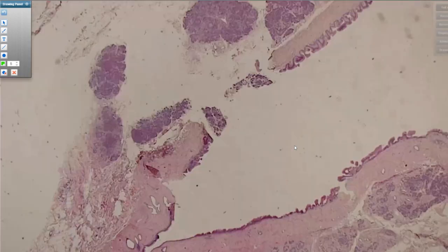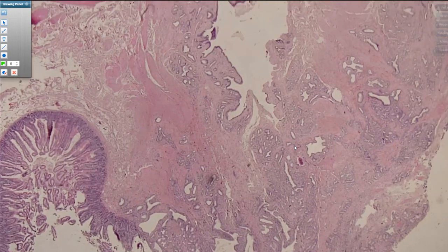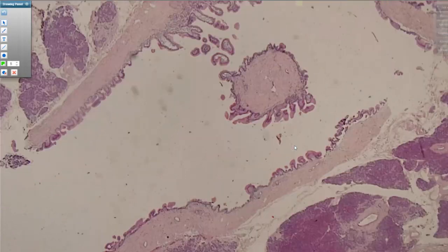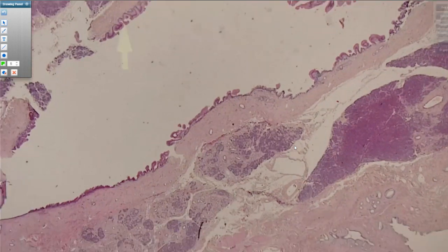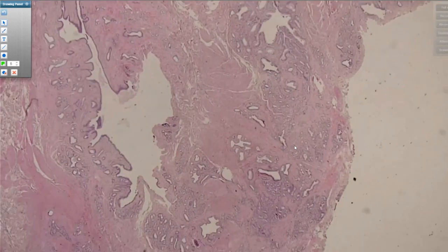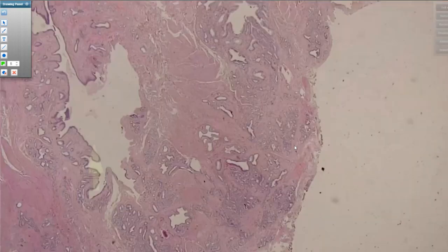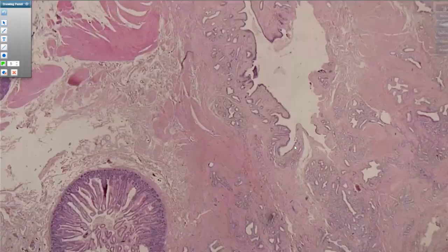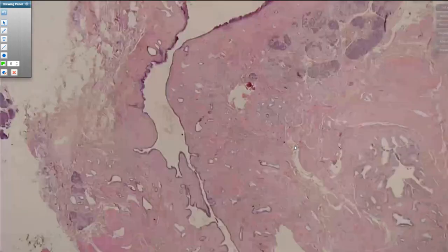I chose this slide also just to highlight that they can not only expand out the ducts within the pancreas, but they can crawl up the main pancreatic duct, and this is a section coming into the ampulla where you can see the IPMN slowly crawling up near the ampulla to empty into the duodenum. And they can do crazy things like grow all the way up, colonize the duodenal surface, and then even invade back through the duodenal wall. So they really like to go all over the architecture in the area.